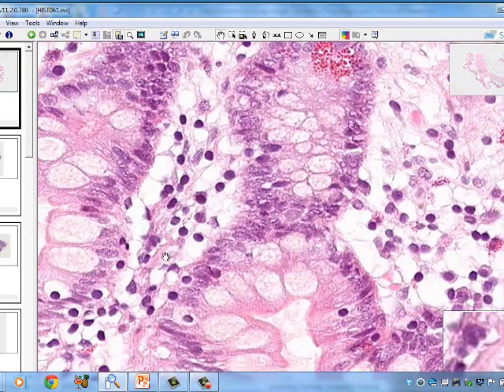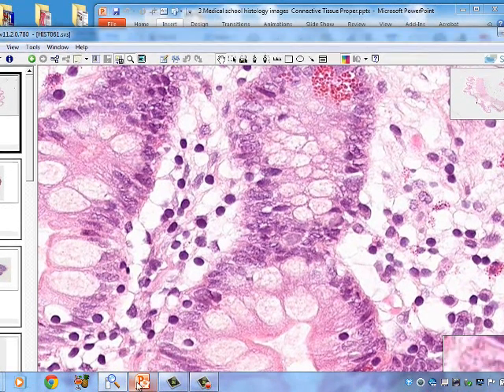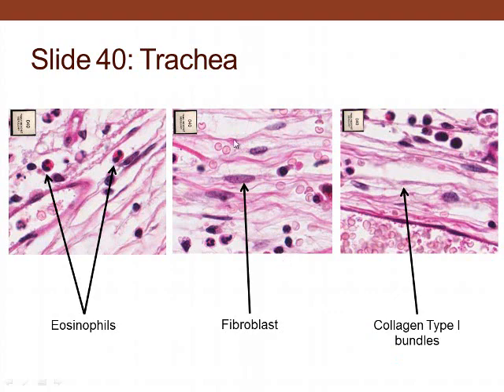The next slide is of the trachea. We can see eosinophils, fibroblasts with a small amount of cytoplasm on either side of the nucleus, a nucleolus, and collagen bundles in the extracellular matrix — produced by these fibroblasts.